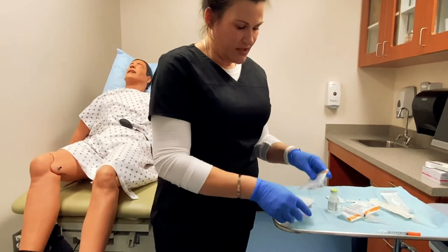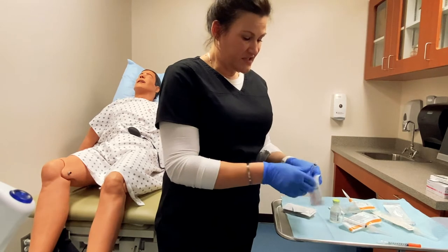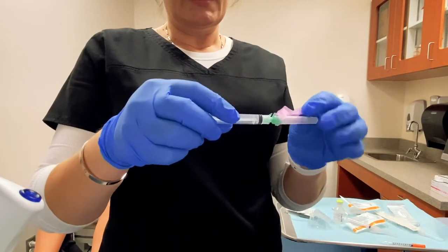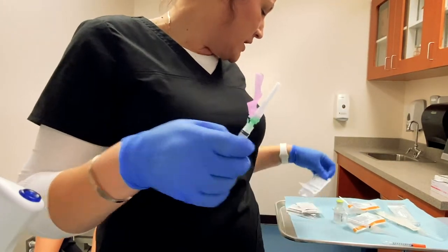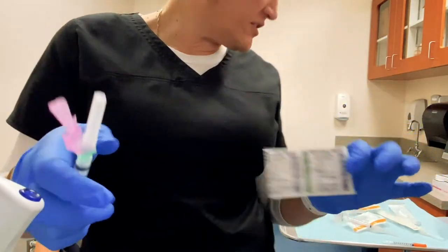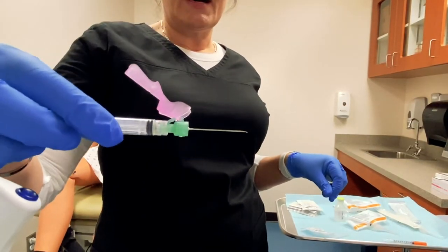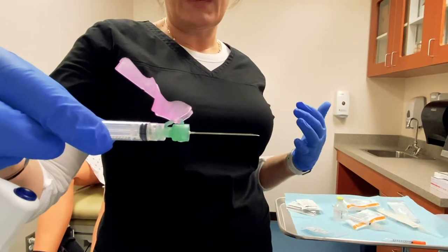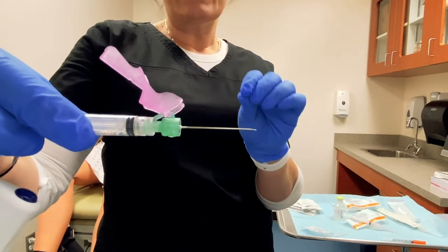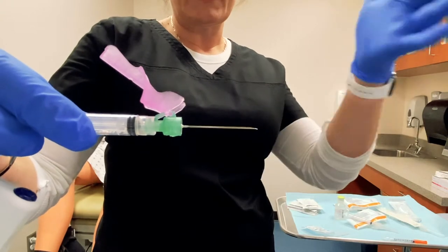I don't have any intramuscular injection syringes that come with needles — I need to order some — so instead we're going to make do. This is a 21 gauge, one and a half inch needle. That one is 21 gauge, so it is the biggest of the needles we have in class and it is an inch and a half long. That is because this is going to be used for an intramuscular injection, and we have to go through the subcutaneous tissue, the fatty tissue, to get down to the muscle layer, so we need the needle to be just a little bit longer.